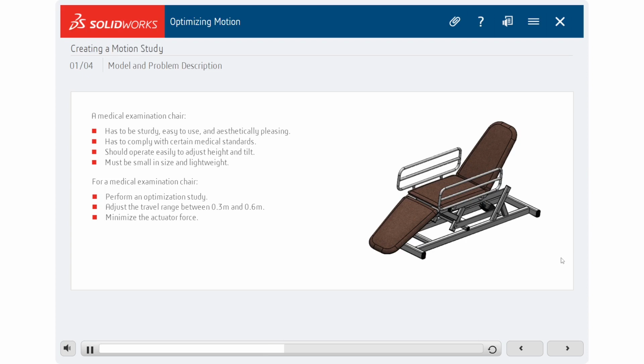In this module, we will perform an optimization study to size the actuator mounted on a medical examination chair. The medical examination chair needs to have a certain range of travel, but at the same time, we have to limit the size of the actuator to raise or lower the chair. The travel of the chair is between 0.3 meters and 0.6 meters.